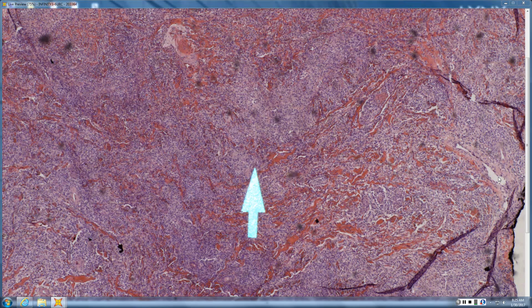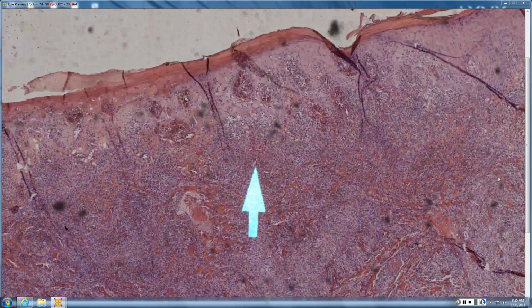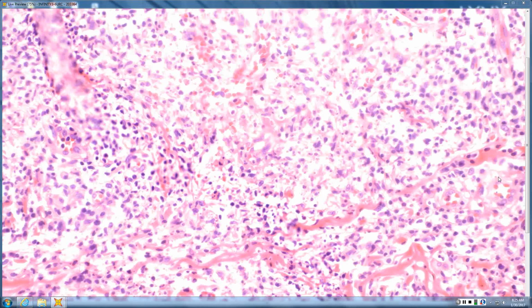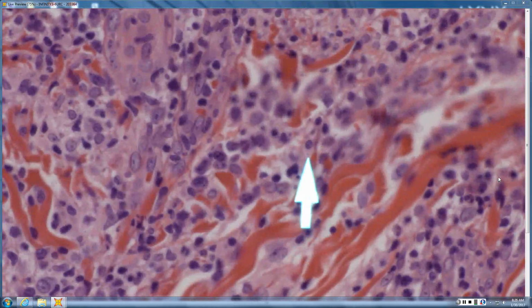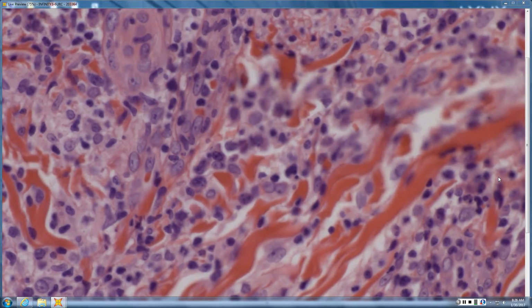Definitely looks like you have acanthosis, maybe even pseudoepitheliomatous hyperplasia. And there's definitely a large infiltrate taking up most of the dermis. Okay. So we sort of have PEH and pus, and then a large infiltrate taking up most of the dermis. They look histiocytic. Anything sitting within the histiocyte? Maybe. Some little gray things, maybe. So what are you thinking? Possibly. It could be leish.